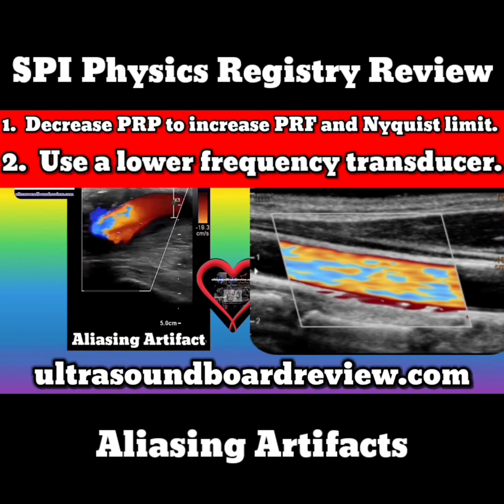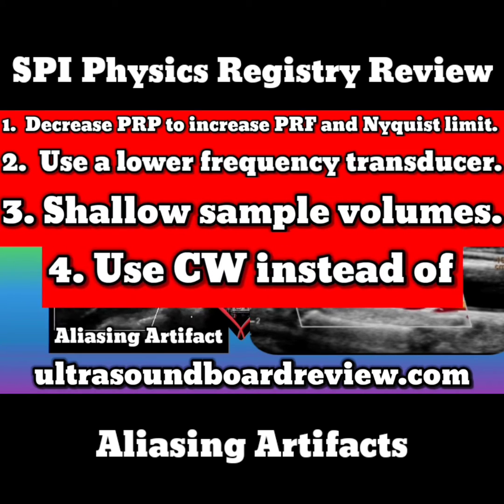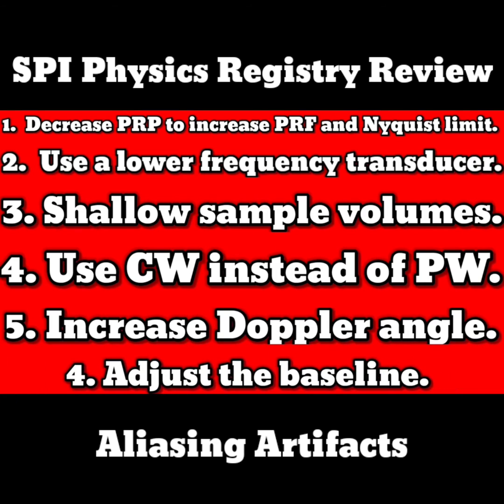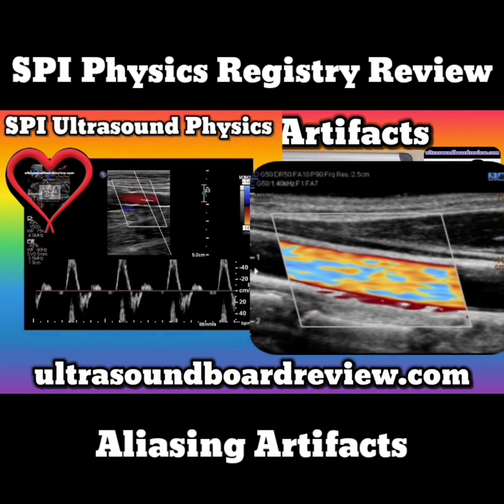You can also try choosing a shallower sample volume, changing from a pulse wave to a continuous wave Doppler, increasing your Doppler angle, which then decreases the Doppler shift for a given flow, or adjust your baseline shift. Lower shifts are less likely to exceed the Nyquist limit and therefore less likely to alias.